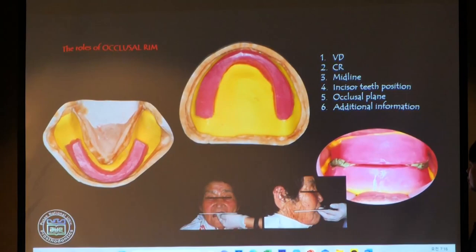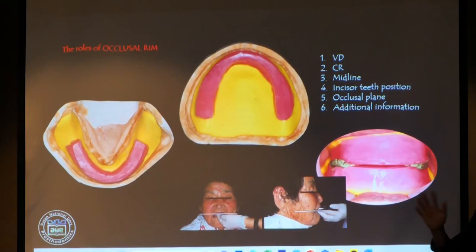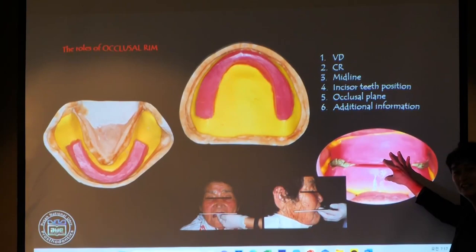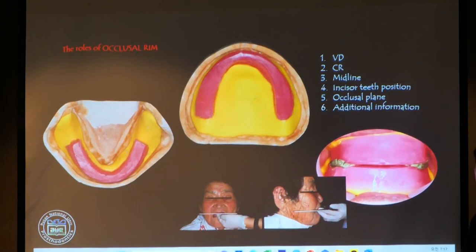We didn't think about another method. Why have we used this method for 100 years? I don't know exactly the weather of California. Anyway, in hot weather, this wax will definitely melt. You know, right? Korea has this terrible summer weather. So whenever I send this occlusal wax rim to another dental lab, I get a call from the dental lab saying the bite has melted perfectly, and they wanted to pack it with an ice pack. Is it fish? Is it meat?